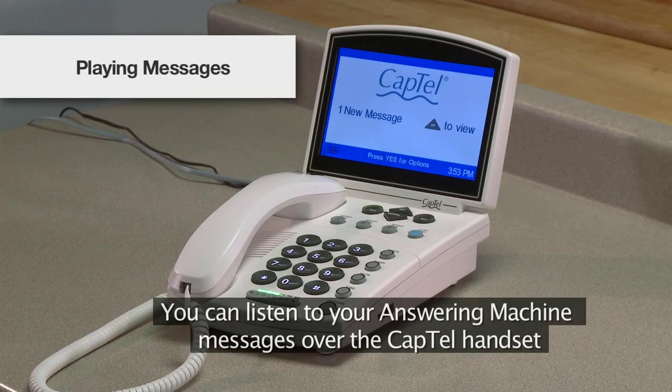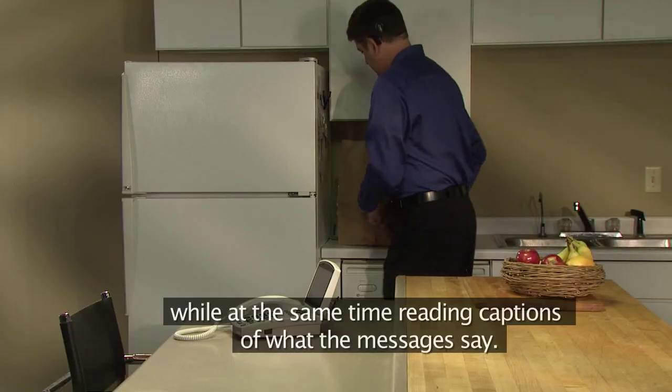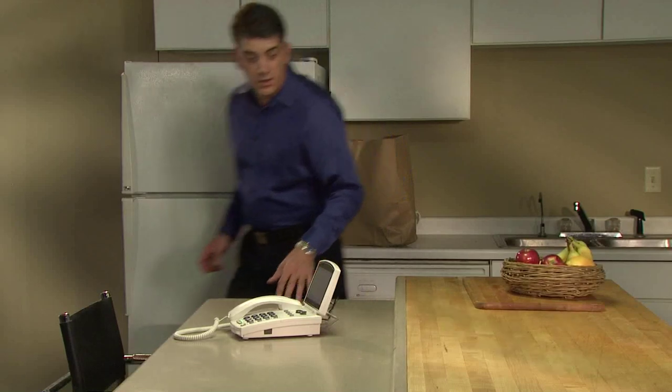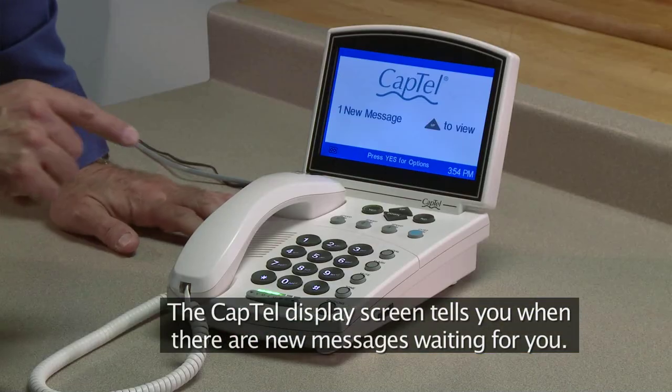You can listen to your answering machine messages over the CapTel handset while at the same time reading captions of what the messages say. The CapTel display screen tells you when there are new messages waiting for you.